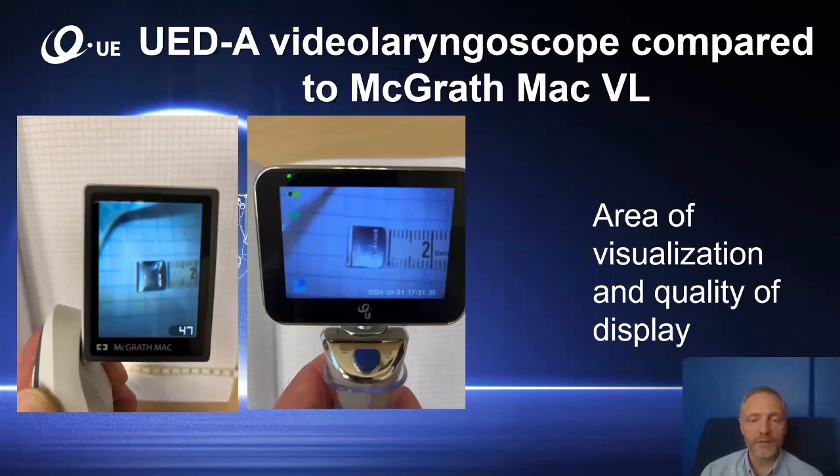And what is the clinical influence of this area of visualization? If you have a wider area of visualization, you can have a better picture of the surrounding tissues, surrounding structures of the entrance to the larynx.